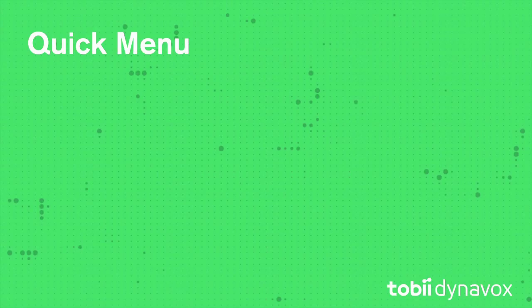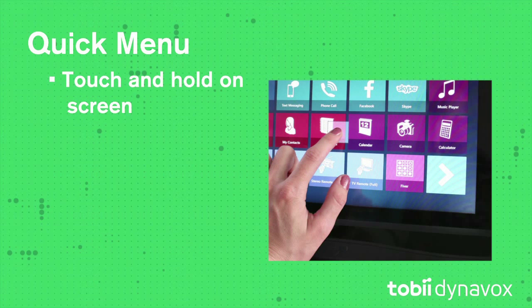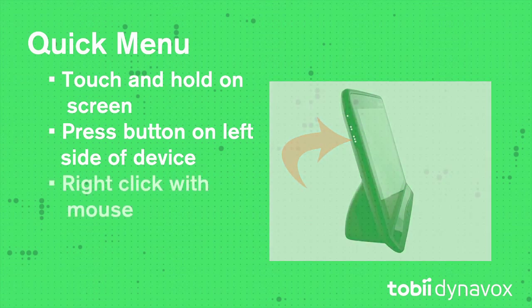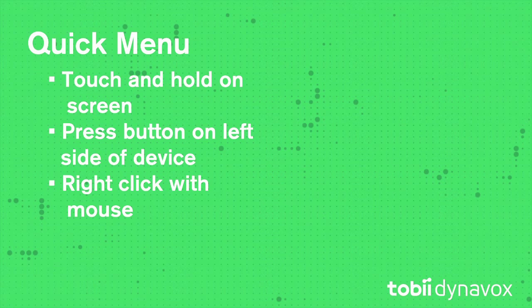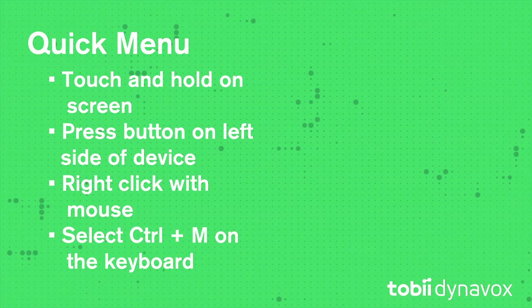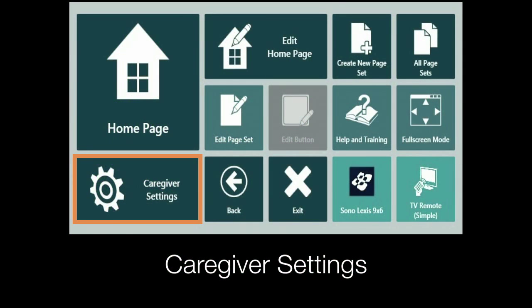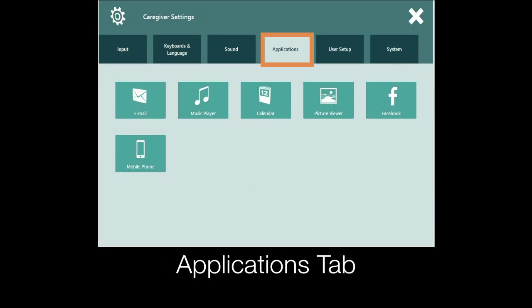In the Communicator software, you will need to access the caregiver settings in the Quick Menu. To open the Quick Menu, you can touch, hold and release anywhere on the screen or press this button on the left side of your device. You can right-click if you're using a mouse or select Control-M on the keyboard. From here, select Caregiver Settings, Applications tab, and then Mobile Phone.